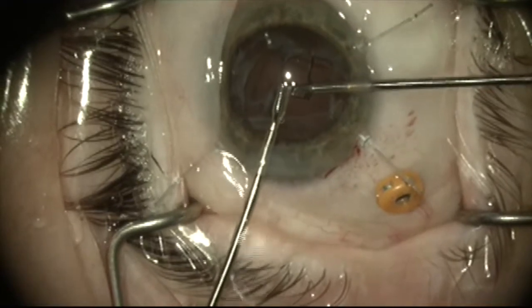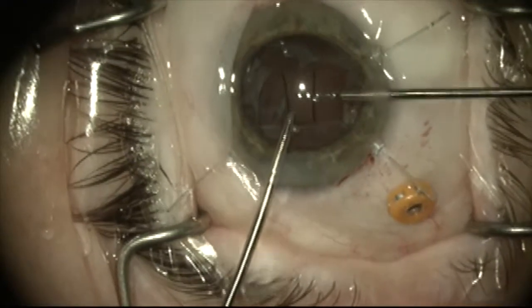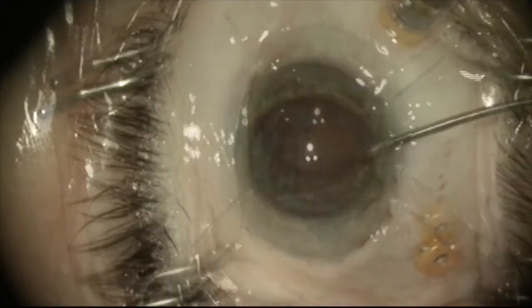You have to be careful not to drop these remnants in a vitrectomized eye because they can end up falling to the back of the eye.